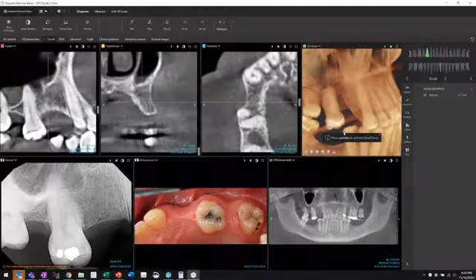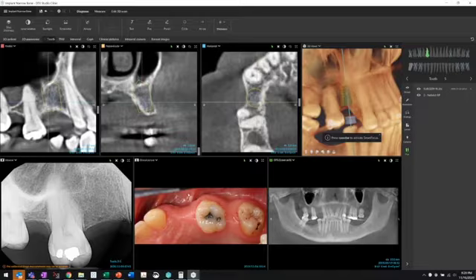The other week I had a patient come in and he had a number of issues, right? We were missing tooth number 5 and that was the big issue for him. He wanted to make sure that he had a tooth that he could put back in number 5. The problem is that he had lost it years ago. So we had some bone loss. So we took an intraoral scan, right? I took a 3D image, of course. I had a PA and a bite wing. We're checking for decay as well as extraoral photography. So I was able to incorporate all of those images into one platform, started to do some treatment planning.